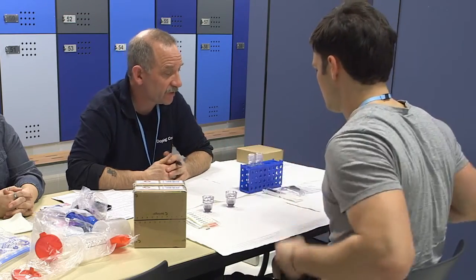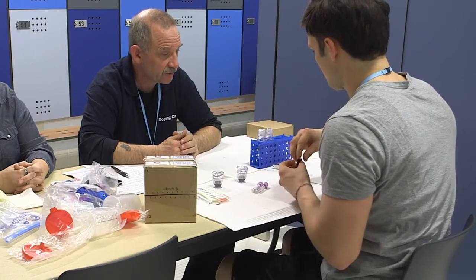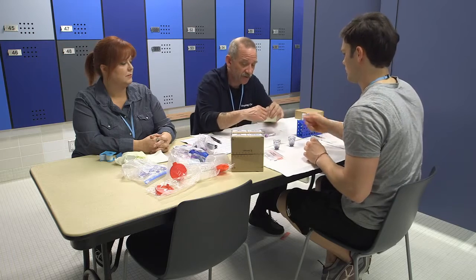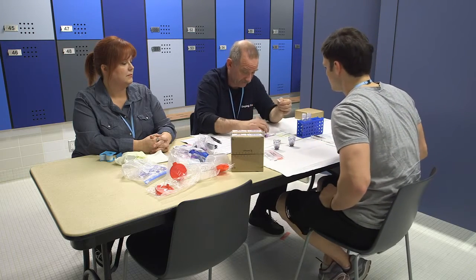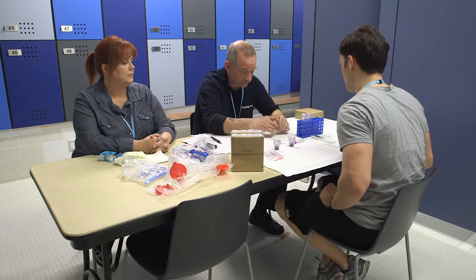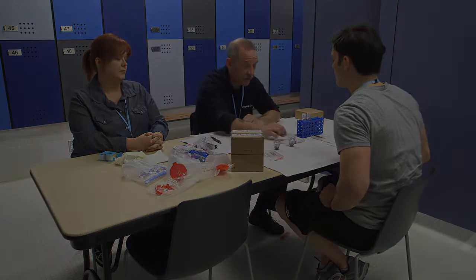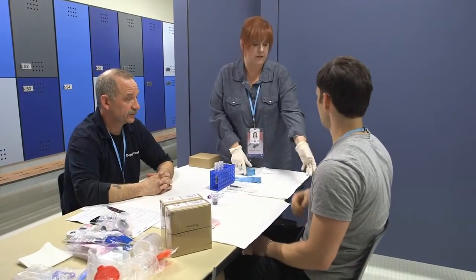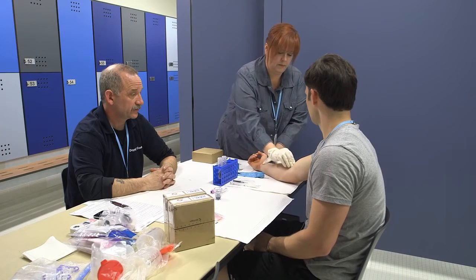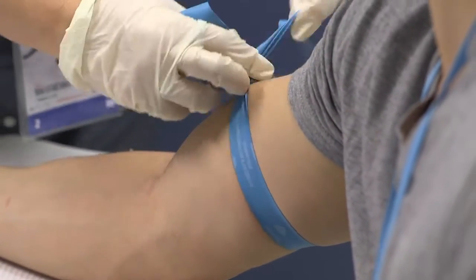Once you are ready to provide a blood sample, you will follow a very similar process as with the urine sample collection. You will select a blood collection kit, inspect it for damages, remove the plastic packaging, and verify and document the sample code numbers. You will be asked to place the bottles in the holder and the caps on the table. You will select and open a packaged needle and a package of vacutainers from a selection. Place pre-printed sample code number labels lengthwise on each of the vacutainers, then give the vacutainers and needle to the BCO. They will ensure you have an unobstructed view of the process.